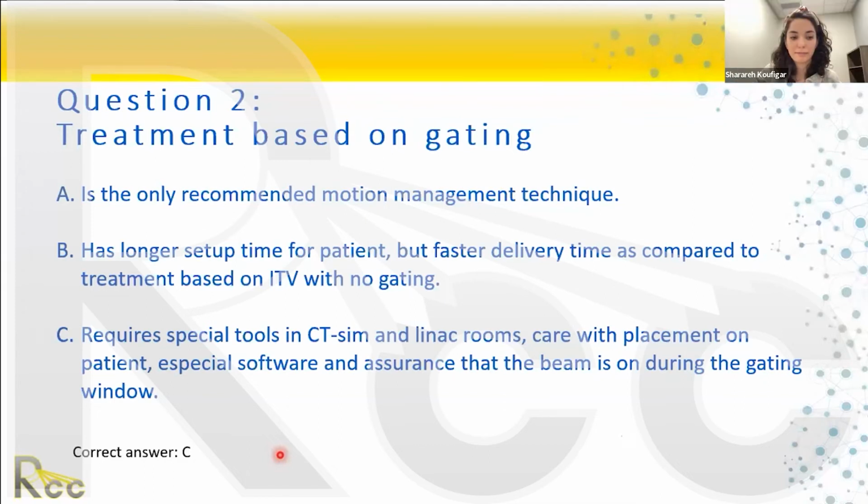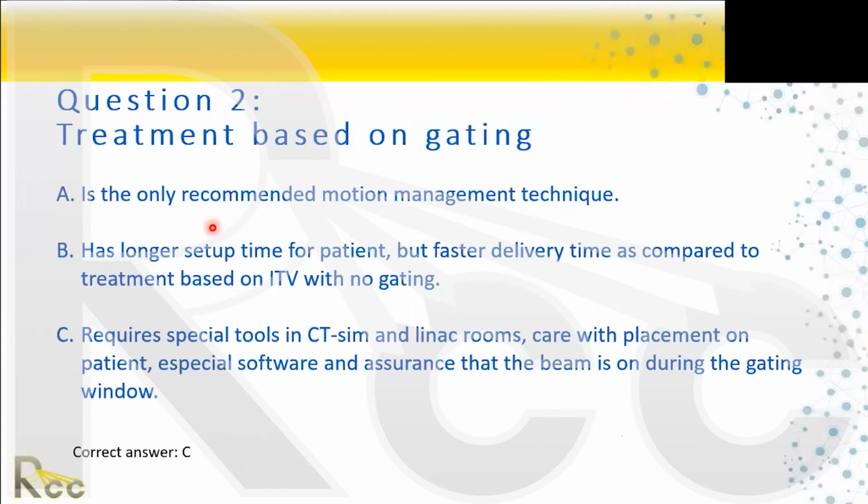No need to put any poll here. The question is already answered. The question says, treatment based on gating is the only recommended motion management technique? Clearly not.